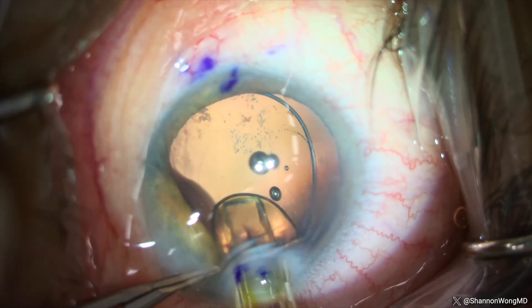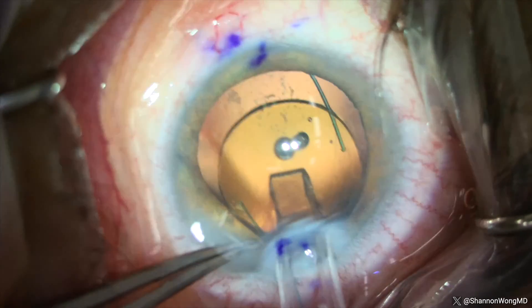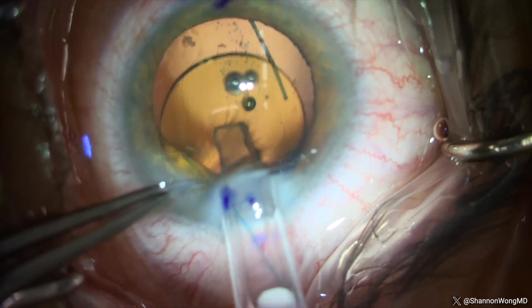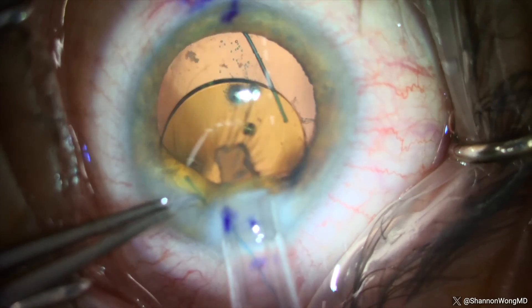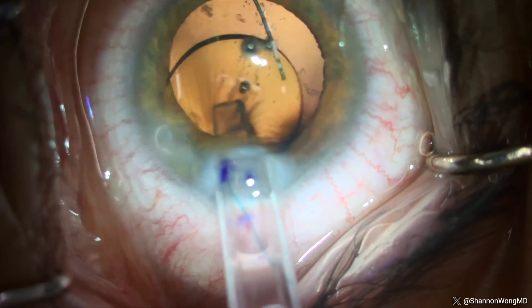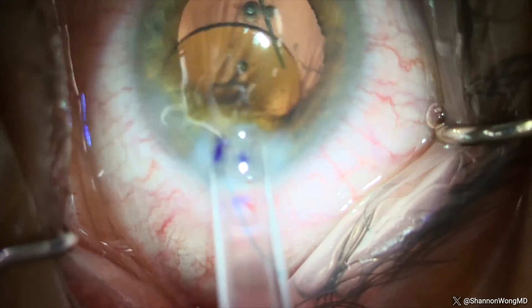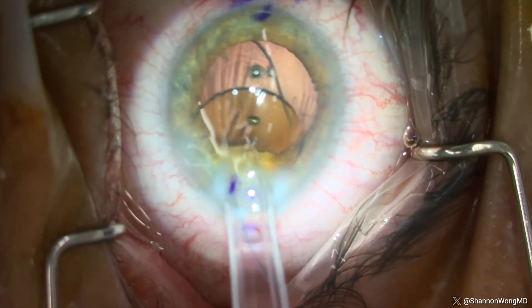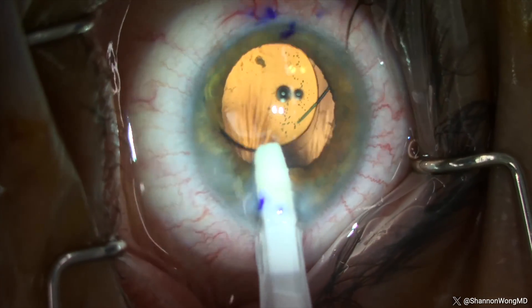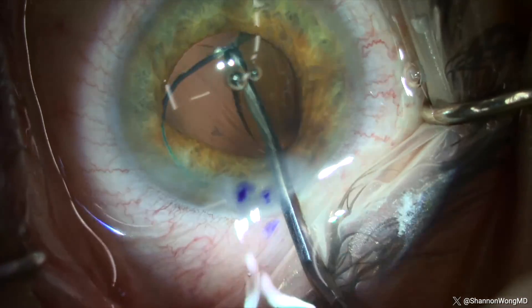The lens is delivered in a planar configuration, which is good, so we're not dealing with the LAL rotation we experienced with the LAL-approved injector. When we retract the plunger to a position that enables us to push the trailing haptic into the eye, there is again more resistance than we experience with the LI 61 AO. In order to deliver the trailing haptic, we have to slowly remove the tip of the soft port injector from the eye, which causes the LAL optic to contact the angle of the eye and exit the tip of the cartridge — allowing us to push the trailing haptic out and into the anterior chamber. A second instrument is used to dial the trailing haptic into the capsular bag.